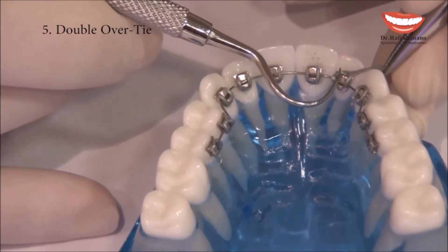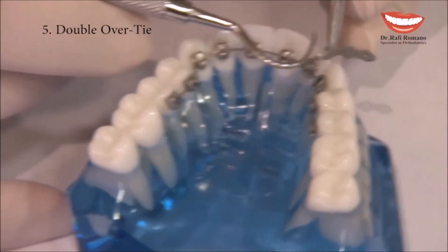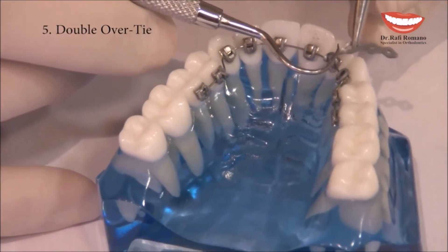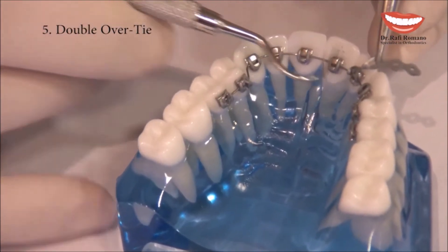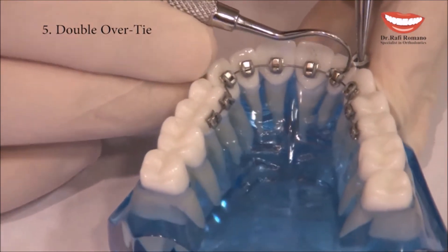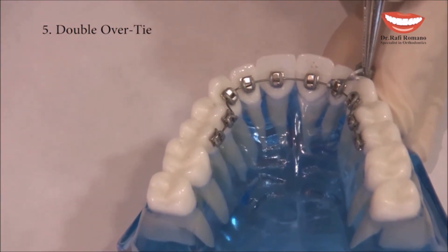Let's imagine that this tooth is outside of the arch. You can use not the same module but the second one, and then you have a very small force pushing the wire slowly into the slot. In the next visit, you go to the full Double Overtie, which gives you one module around the bracket.